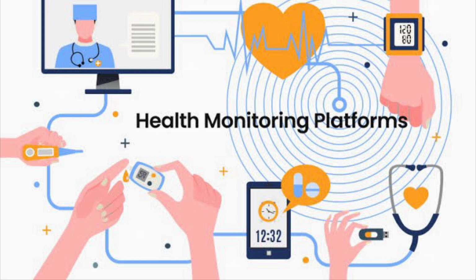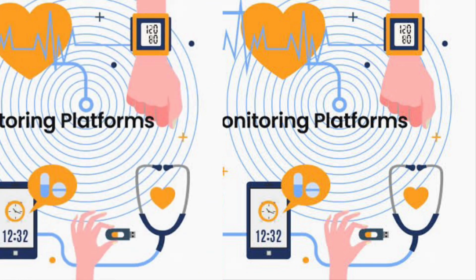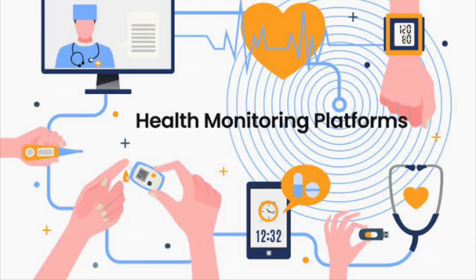This will take some time because this technology is evolving day by day. Wearable technologies can monitor many vital signs like oxygen saturation, cardiac rhythm, respiratory rate, body temperature, and the physiological status, whether the patient is standing, walking or lying, to identify whether he has fallen down, and lastly the blood pressure. For example, in an Apple Watch, everything except blood pressure can be recorded. And there are devices available now where glucose can be monitored continuously.